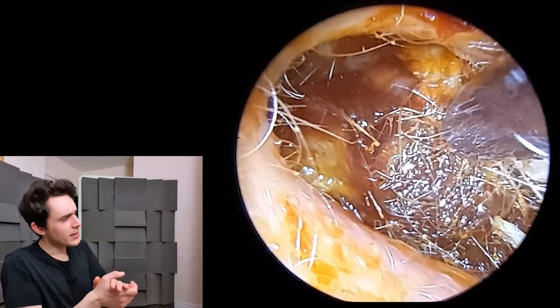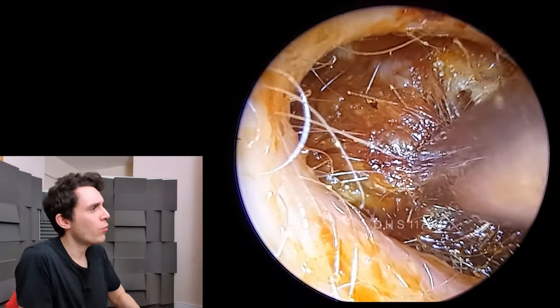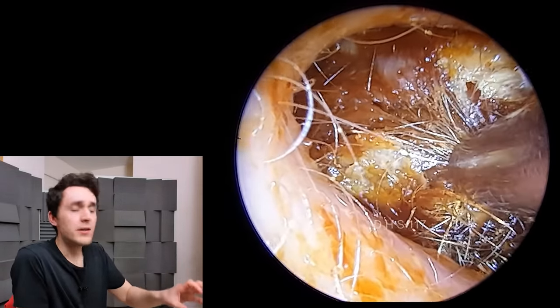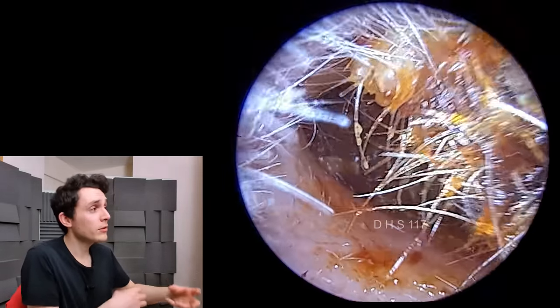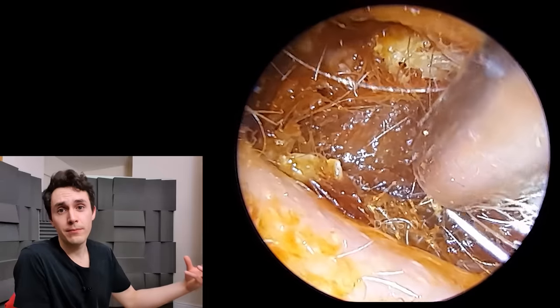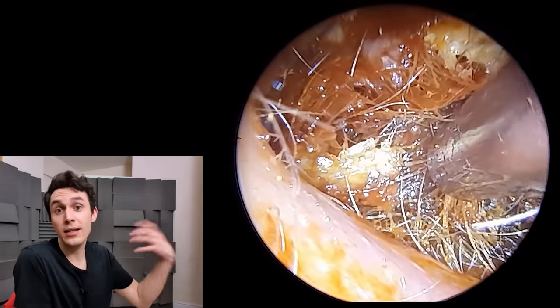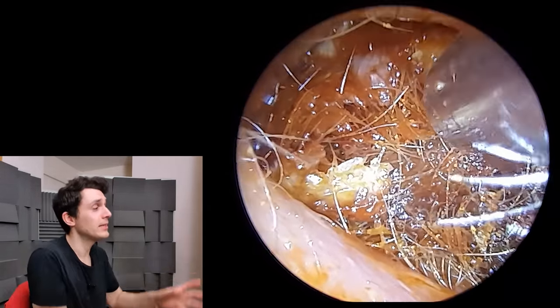What we have here is a gentleman who is in a lot of pain and he's been in quite a bit of pain for a while. He went to his local doctor. The doctor, as a precaution, prescribes some antibiotics. But that hasn't helped. So the doctor has advised that he see me for some clearance, which is obviously needed.